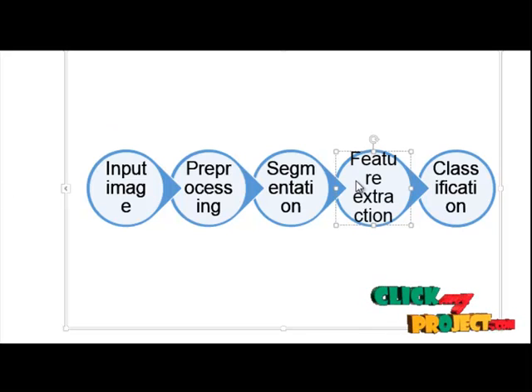First we are going to discuss GLCM. GLCM is the gray level co-occurrence matrix. It contains information about the positions of pixels having similar gray level values. A co-occurrence matrix is a two-dimensional array in which both the rows and the columns represent a set of possible image values.